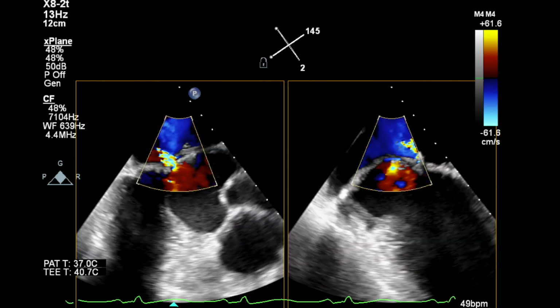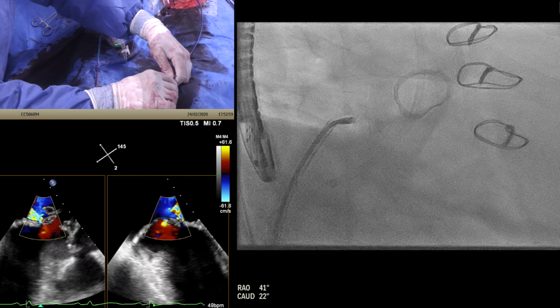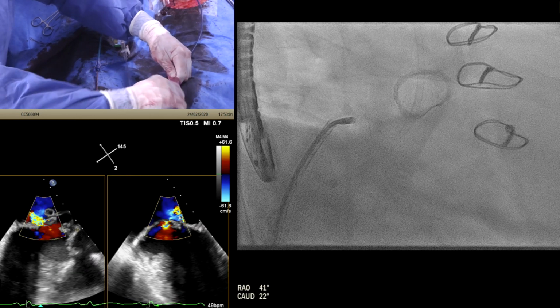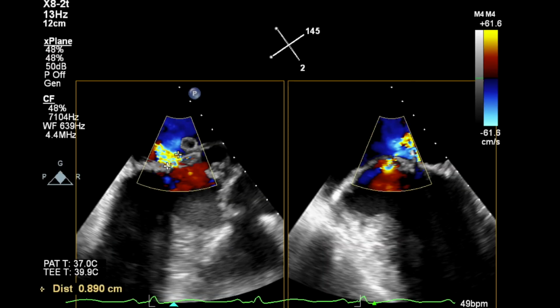Okay, so let's keep control of all of that. Let's stick a syringe on there. Okay, that's a long while we journey. Acquaint ourselves with what we're going to do here. So I am thinking that this is... Okay, well, I mean, it went through easy, so there's a hole there for sure.